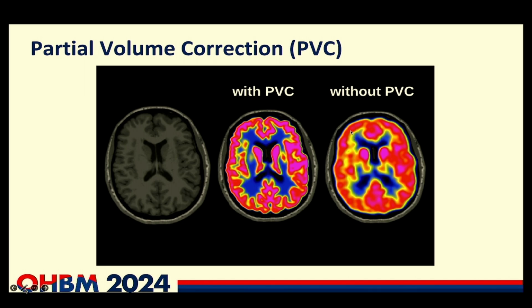You see that it has spread out into the white matter, but you can also see that it has spread out across cortical folding patterns. So the idea with partial volume correction is that you try to account for these spillover and spill-in effects. And there are different assumptions, there are different methods. Again, that's how it is in science. But the goal is to basically correct for this limited spatial resolution. So you get images at the end that look something like this, where you can imagine that the signal has been pushed back into the gray matter.